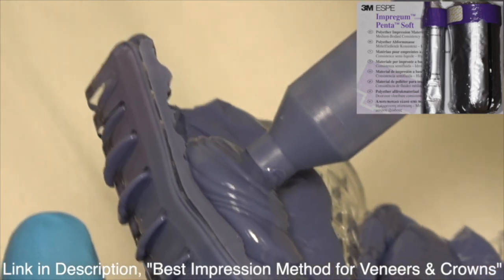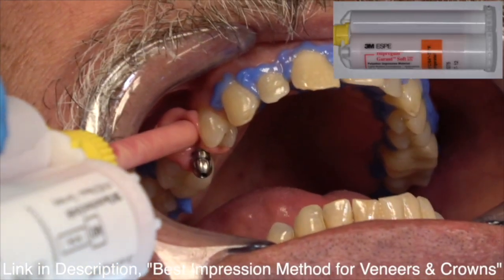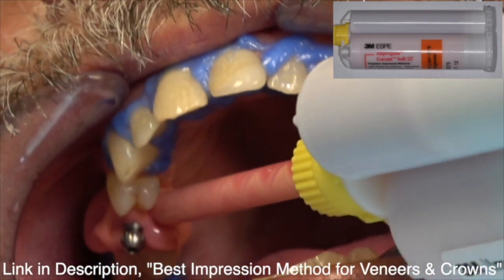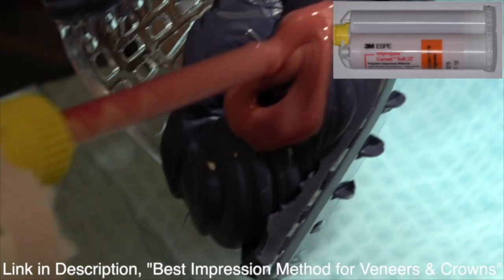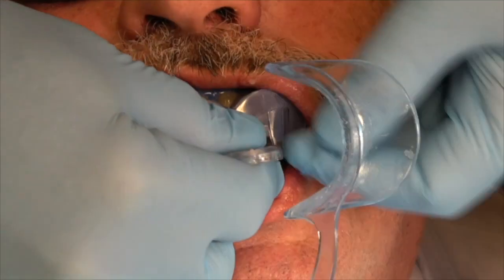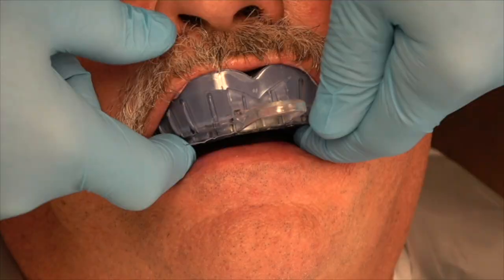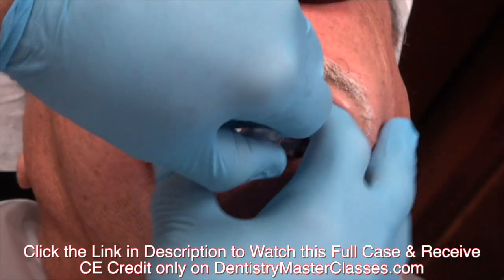I'm going to squirt the wash material around the implant so I capture the soft tissue — squirt it on both sides and put a little bit on the unset polyether material. It's very important you use a custom tray so you don't get blebs and voids in the impression.